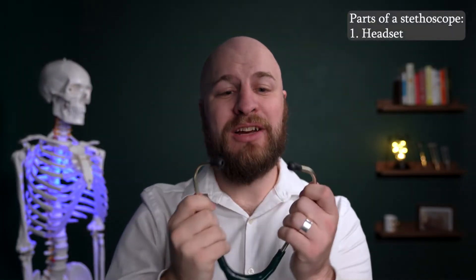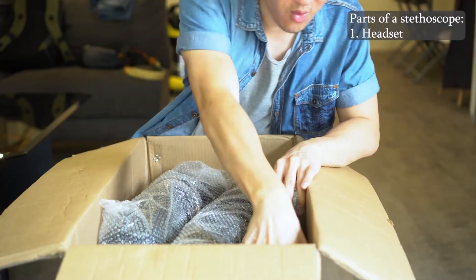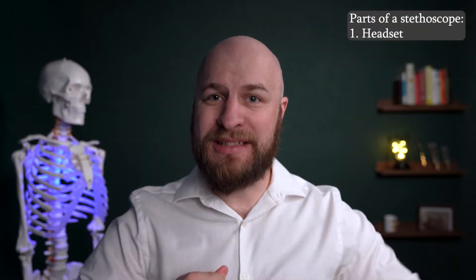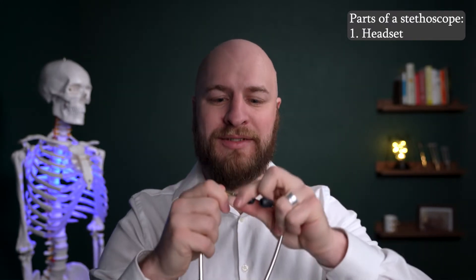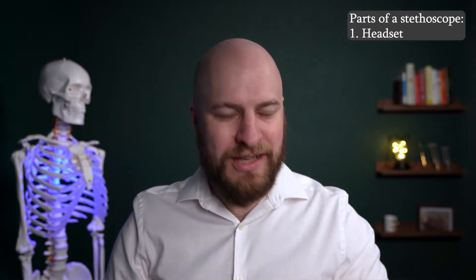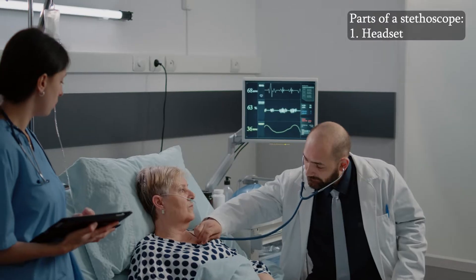Starting up here at the top, we have the headset of the stethoscope. When you get your new stethoscope, they'll come with a couple different options for your earpieces. These can come off and you can adjust them so that they fit your ear canals. It's really important to make sure that these fit well so that you hear a good crisp sound when you're listening.